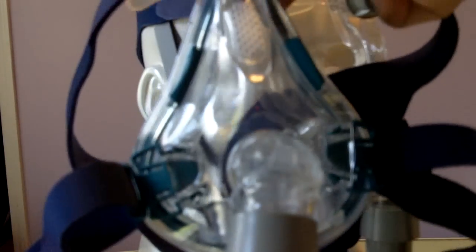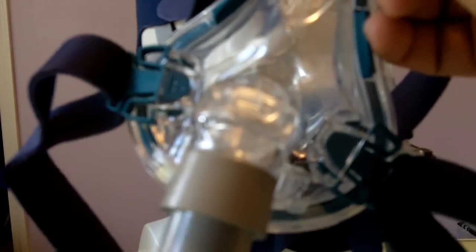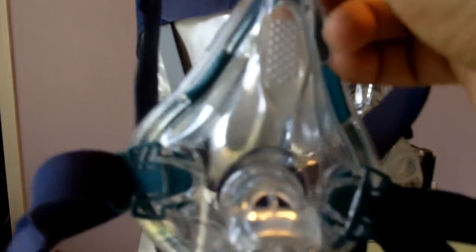Or even with a full face mask. There are many times we have used a chin strap with a CPAP full face mask.